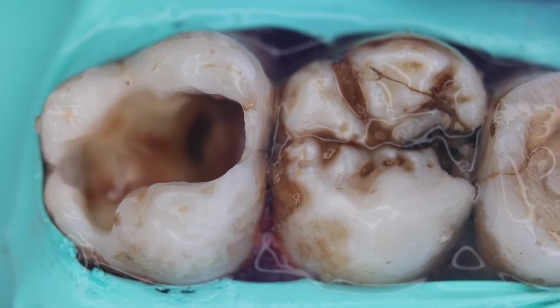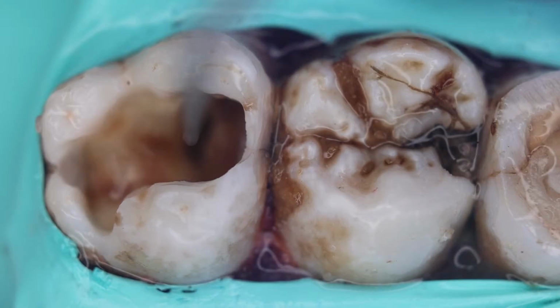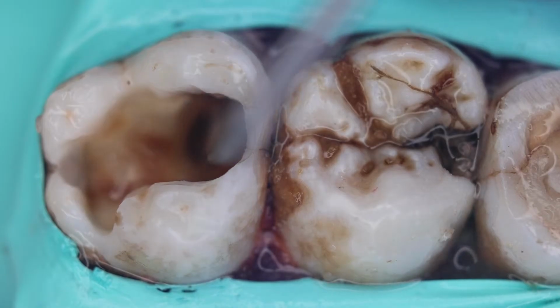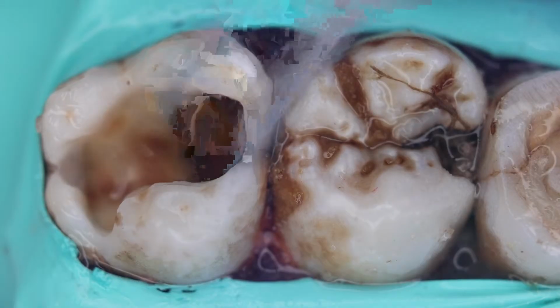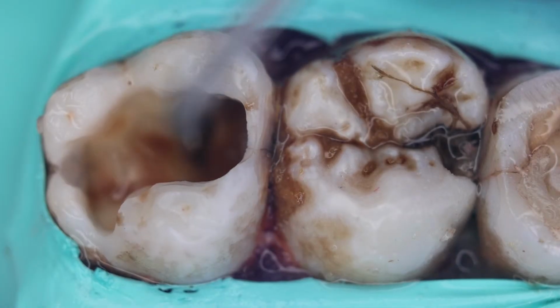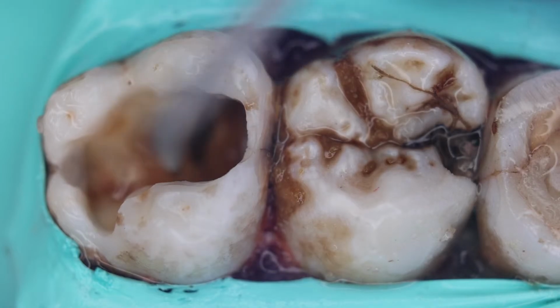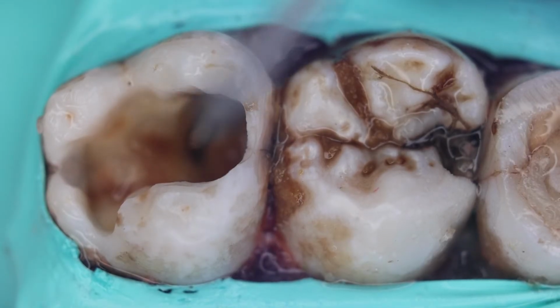Over here I want to highlight one more thing, that since we are preparing the cavity, and what we find now is, when this area is more than 1 millimeter, then we need to plan.